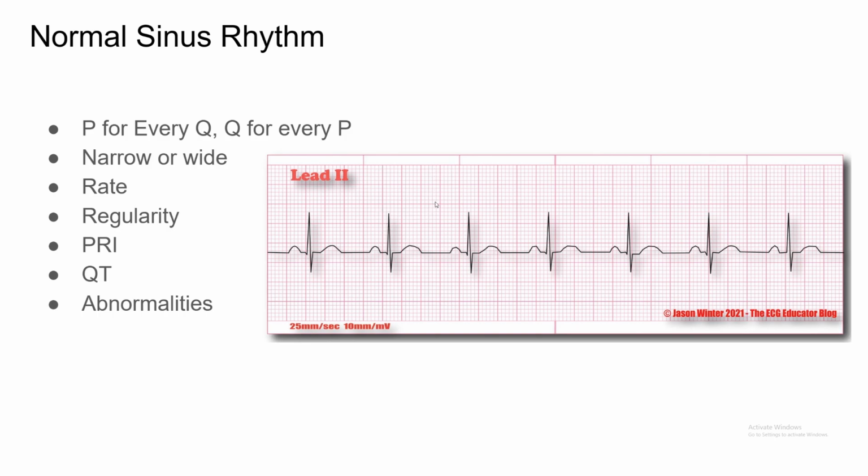What's the rate here? So this is how I count the rate for my EKGs typically. Each one of these big boxes would be equal to 300 if there's a QRS at the beginning of this big box, and there's a QRS after one of these boxes. That'd be 300, right? And then we count down from there, and I'll show you how. So right here, I know it's not perfectly at the edge, so just bear with me here.